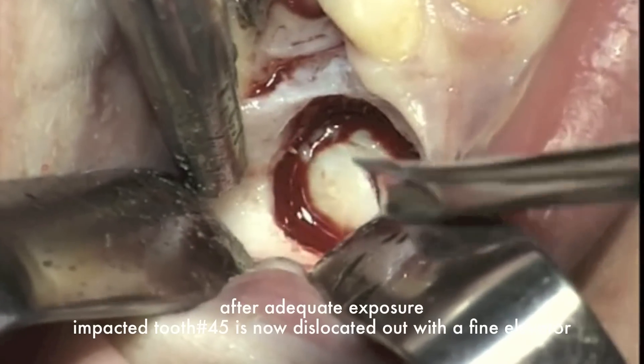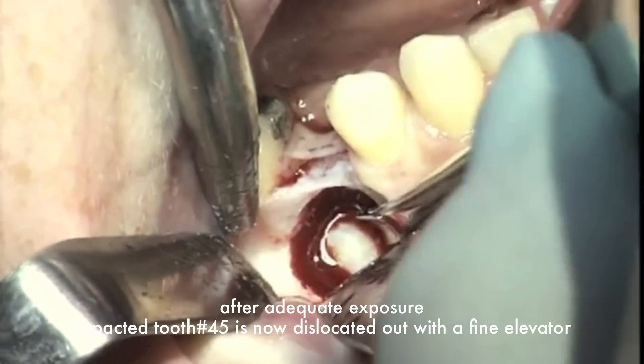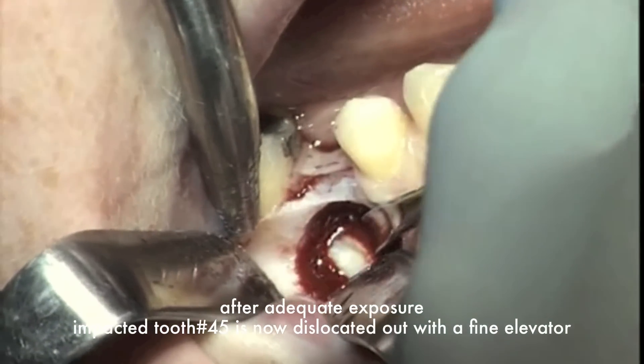After adequate exposure, the impacted tooth 4-5 is now dislocated out with a fine elevator.